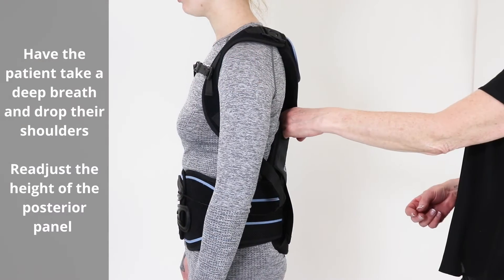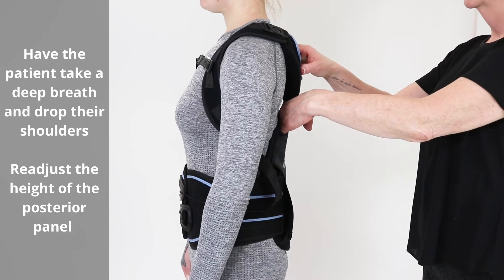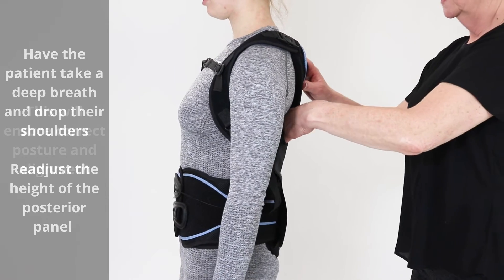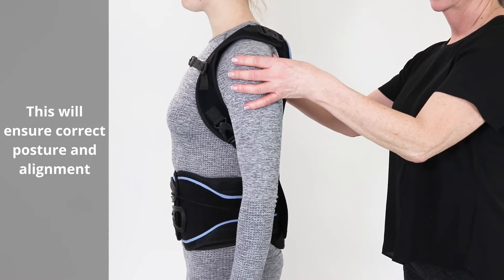Have the patient take a deep breath and drop their shoulders. Readjust the height of the posterior panel to ensure correct posture and alignment.